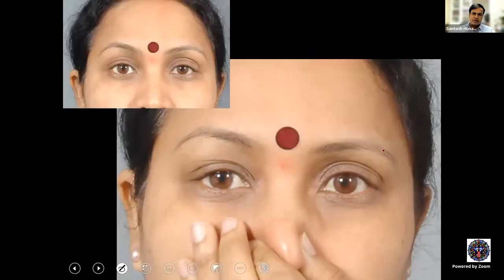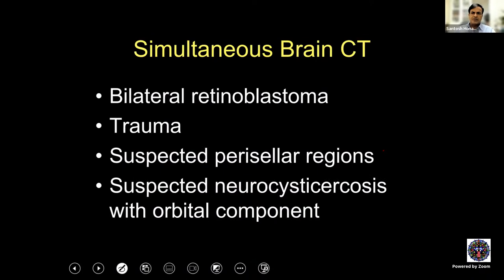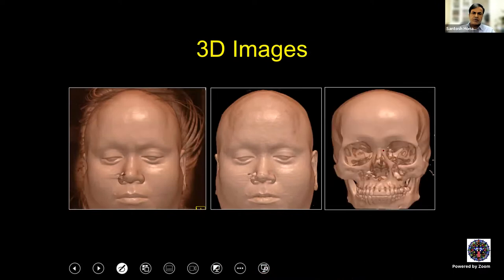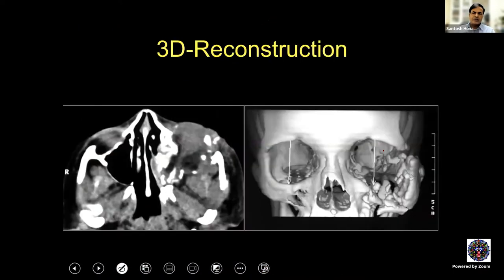This is one example of a patient where there is subtle enhancement in the amount of proptosis when she attempts the Valsalva maneuver. A simultaneous brain CT scan is requested when a patient has bilateral retinoblastoma — though MRI is the most preferred investigation. For trauma, you definitely want brain imaging along with orbital imaging. Suspected perisellar lesions and suspected neurocysticercosis with orbital component are also indications. 3D images may be important if you're planning orbital fracture reconstruction or have a complex clinical situation where you really want to reconstruct the orbit optimally.